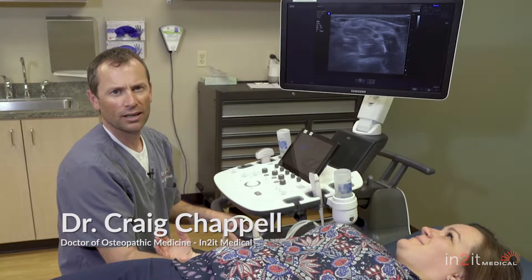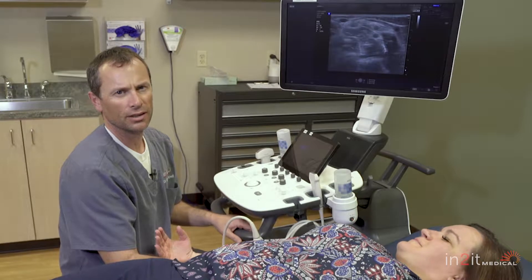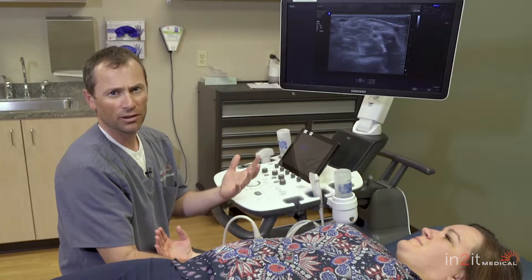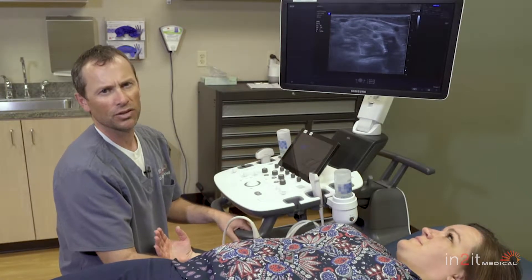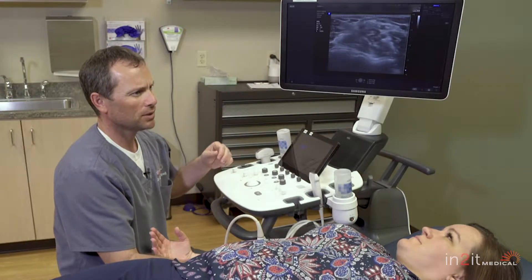My name is Dr. Craig Chappell. I'd like to show you some of the uses for ultrasound, specifically in the application of nerve problems, nerve issues, nerve entrapments, those types of things. A lot of people don't know the utility of ultrasound in assessing or diagnosing nerve complaints, nerve entrapment syndromes. So I just want to give you a quick demo of what you can see with ultrasound.